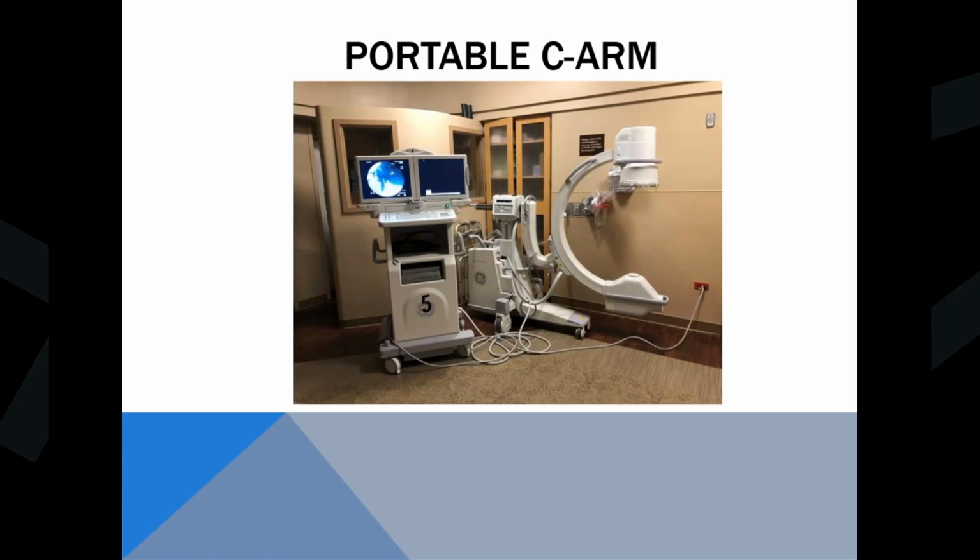Just a little breakdown of it. Right here's where your X-ray tube is. Most of your fluoro systems generally are posterior to anterior, so the beam goes from the patient's back and comes out, and in this case goes through the image intensifier, where there's a camera up here. The camera will record the image and then send it over here. And how you deal with the image, you can control from here.